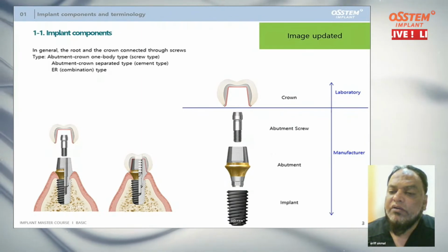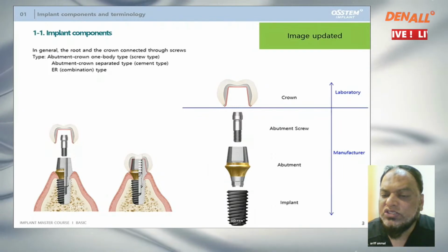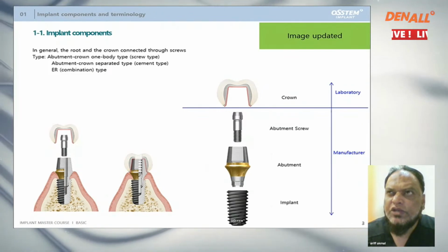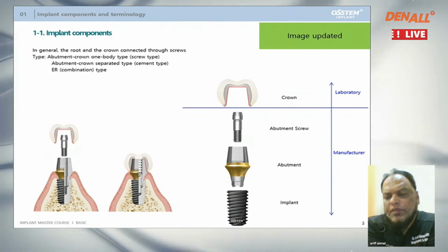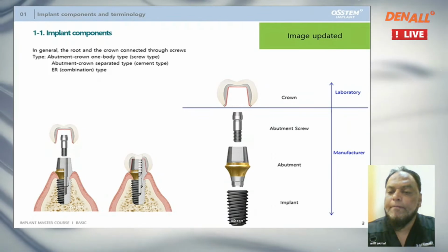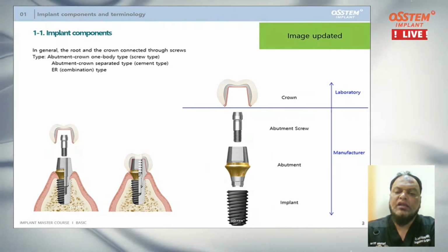I remember a case in the initial stages of my implant dentistry. I had just one implant on my table in stock, and I started placing the implant. I opened the flap. I think a 4.2 into 10 implant was decided. We had planned it by taking the RVG, CBCT and everything. And then we opened the flap, started performing the osteotomy, and when I placed the implant, it started spinning in the osteotomy. That was the learning curve for me.